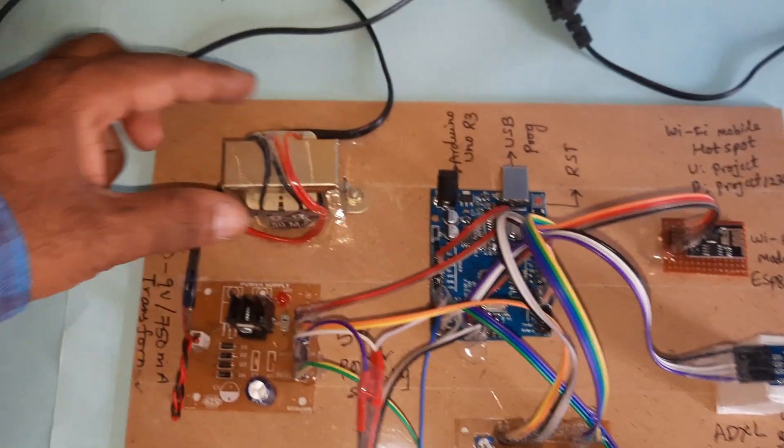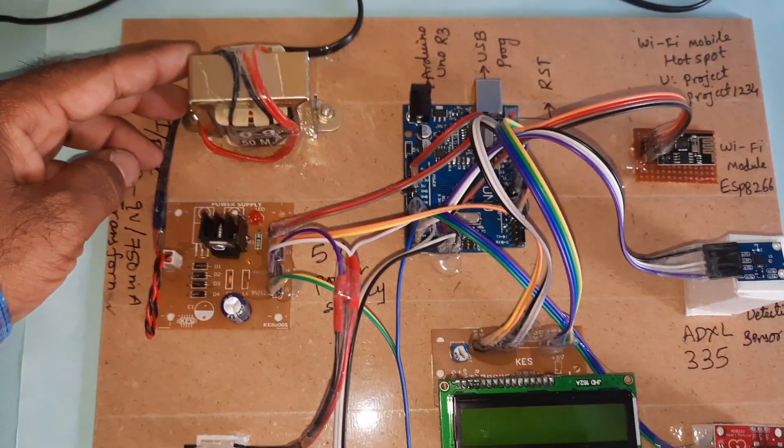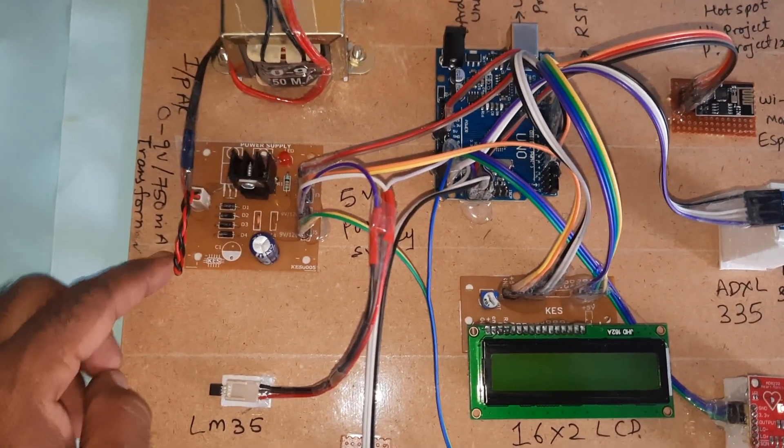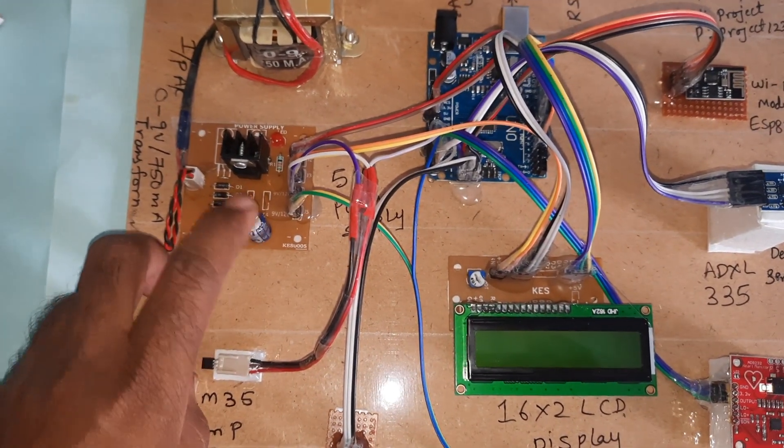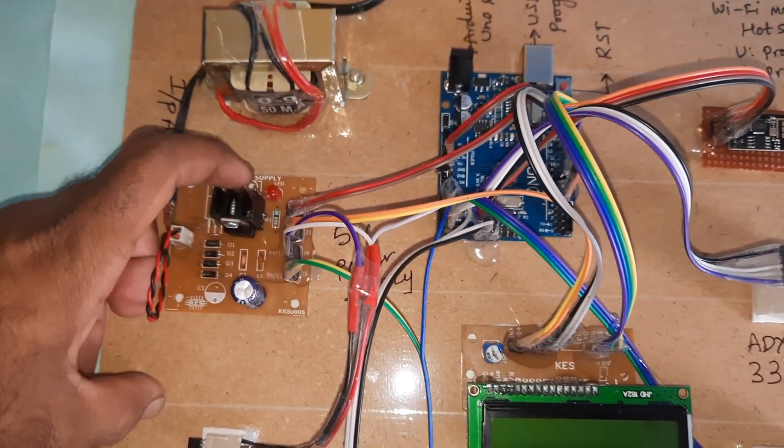The power supply module uses a 230V input step-down transformer with 9V AC output at 750 milliamps, followed by a bridge rectifier, filter capacitor, 7805 regulator, an LED, and a power supply board.